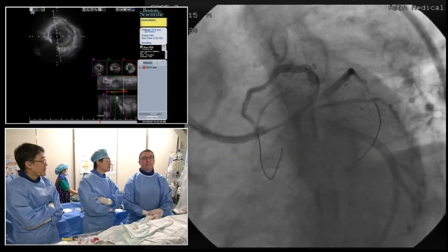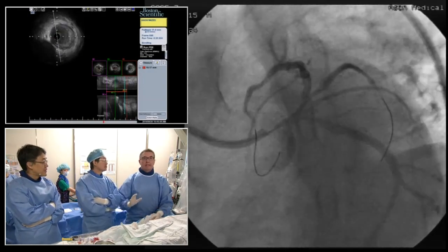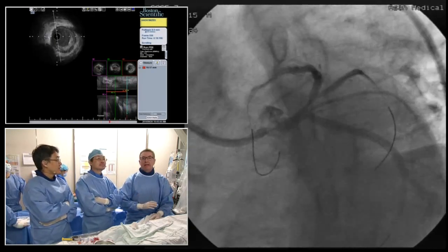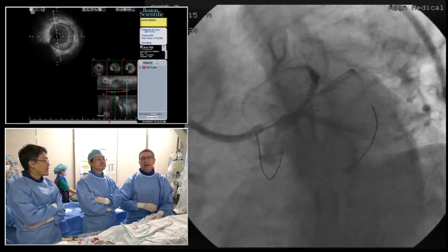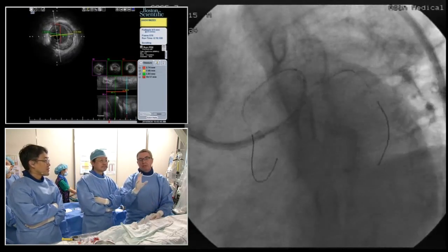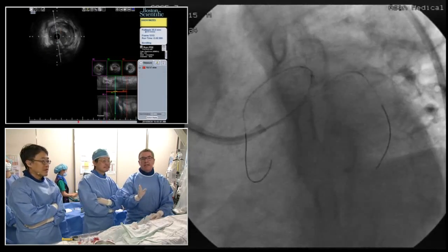We completely agree with those suggestions, Marty. And what we think is that we're going to try and deploy a single stent, cross over into the left main, and then post-dilate the proximal part of the stent in a proximal optimization technique. The problem is here the plaque is relatively soft, and the angle into the diagonal is relatively narrow.